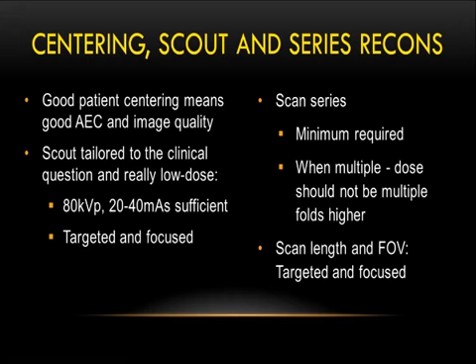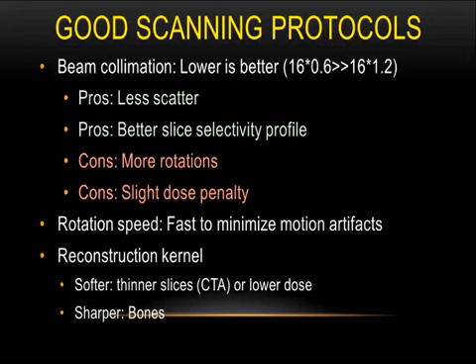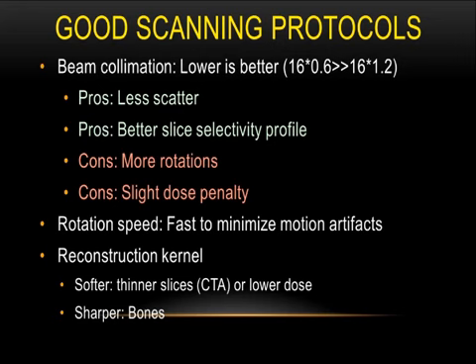Technologists are responsible for tailoring each scout, making sure that the scout is performed at low dose and is targeted. As I already said, they are responsible for scan series and scan length. Okay. There are some other more subtle points about scan protocols that should be kept in mind. One is about beam collimation.